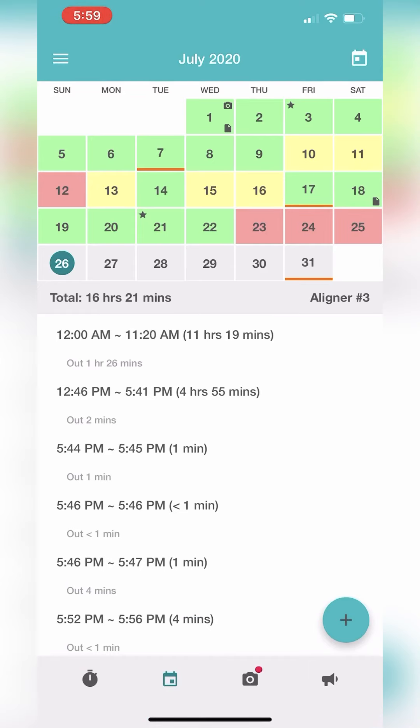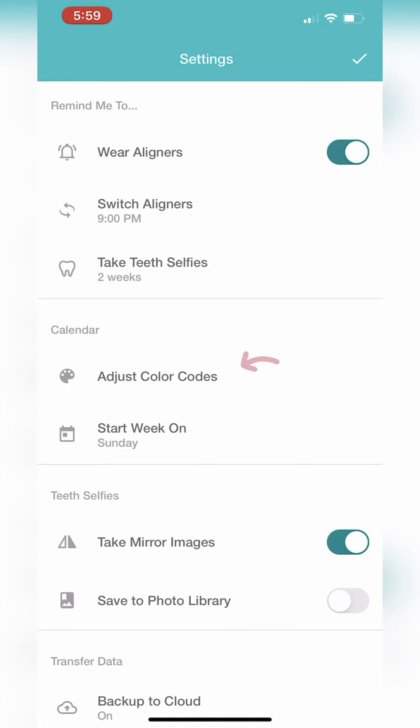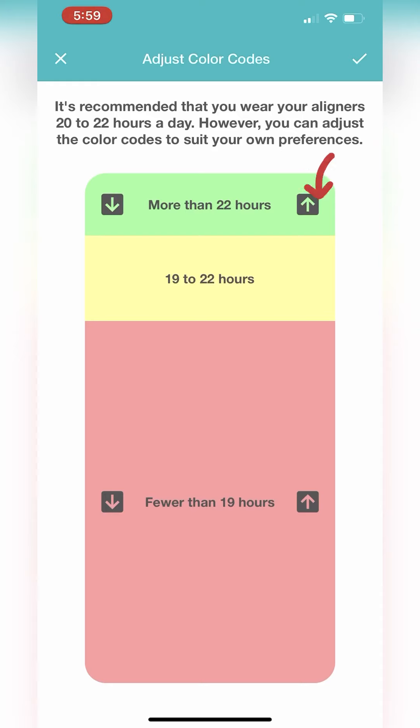To change your wear goals, hit the three horizontal buttons again and select settings. Now tap on adjust color codes, and from here you can increase or decrease your wear goals. In this case, green means I've worn my trays for 22 or more hours per day. Yellow means I've worn my trays between 19 and 22 hours. And red means I've worn my trays for fewer than 19 hours.